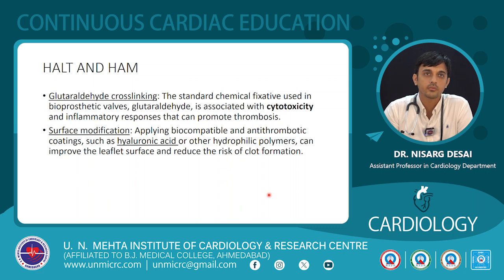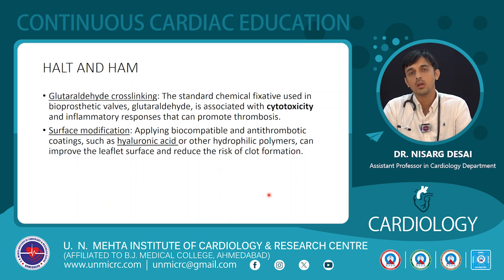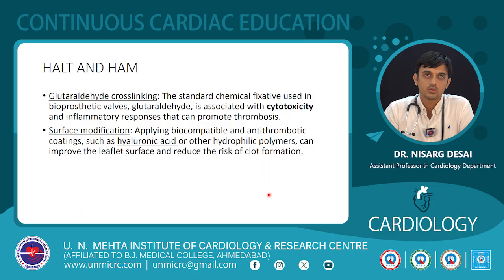And if we are suspecting HALT or HAM using MDCT imaging, then the treatment of choice is anticoagulation. So that's it about the comprehensive echo evaluation as well as the various modalities used to evaluate the prosthetic heart valve. Thank you.